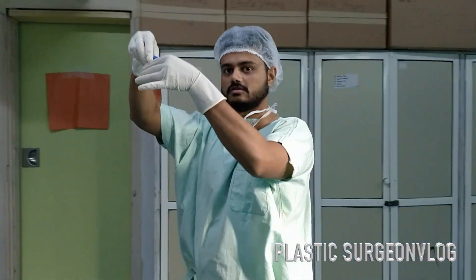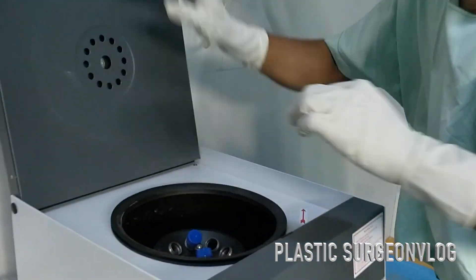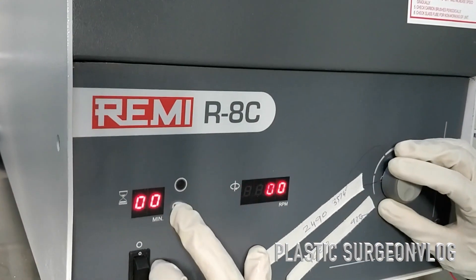After collecting this upper layer of plasma, we will put this plasma into a separate test tube for another spin, which is known as the hard spin.